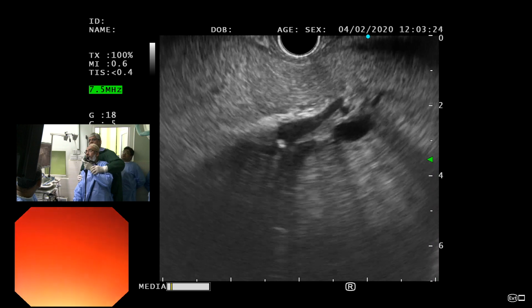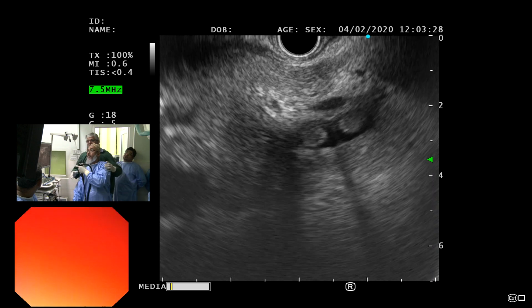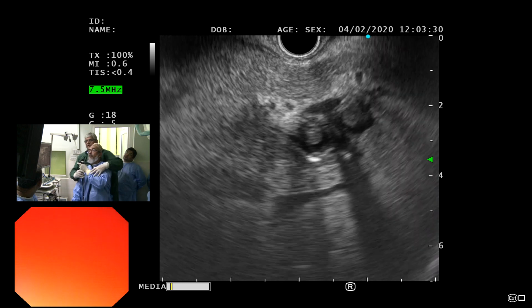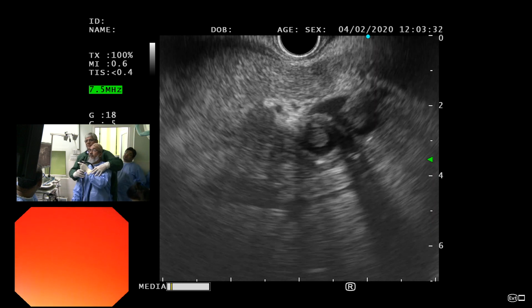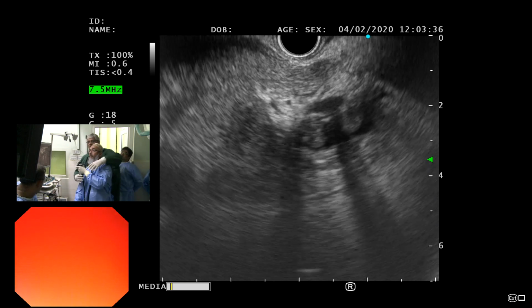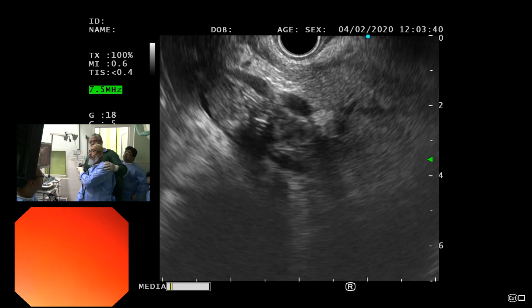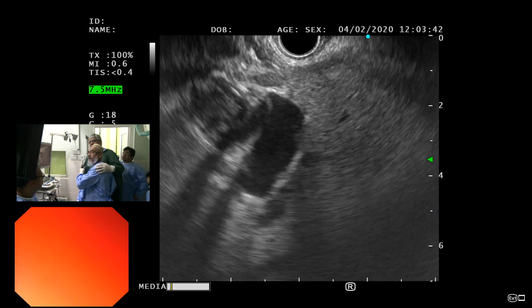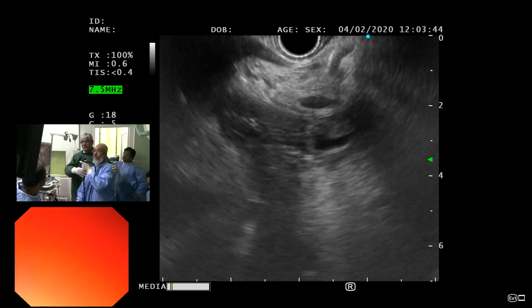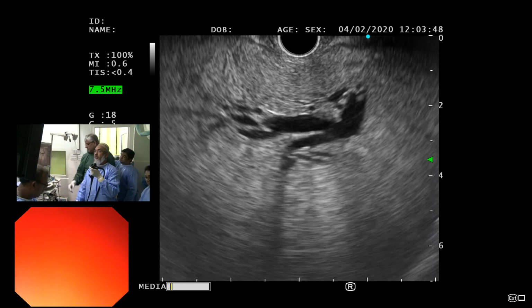The ductal system is dilated. There is at least one area that I saw. There are more there. There, can you see that? I don't know if you can see that clearly. There's that shadowing. अब जाते रहो इसी तरफ, ठीक है, all the way हो गया. लेकिन अब आपका tip up है. जी. Okay, now again do it.